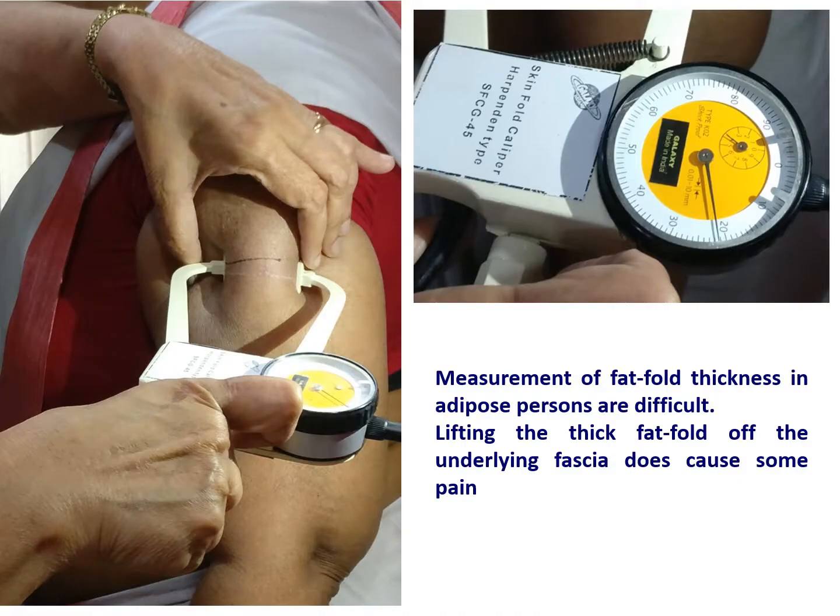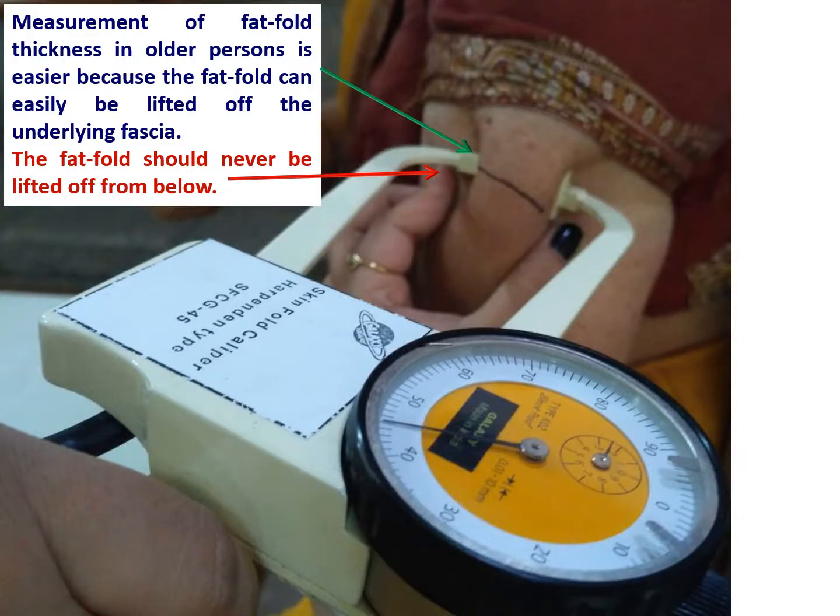The measurement of fat thickness in yet another adipose individual is shown here, and the Harpenden dial clearly indicates high adiposity. Measurement of fat fold thickness in older persons and those who have a more readily pickable, loose fat fold is somewhat easier because the fat fold can then be easily lifted off the underlying fascia.